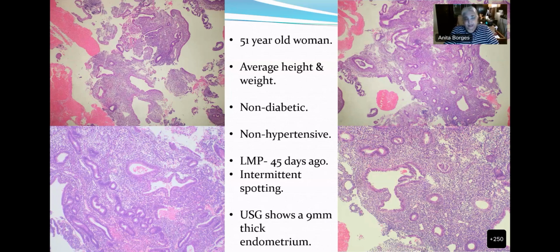And as Dr. Bhupesh said, this is one of the indications for doing an endometrial curettage. So what will you say? Come on, Bhavna, it's not difficult. Yes, ma'am. See, if you're able to describe what you're seeing, you don't have to go into great details. I see these kind of glands and that kind of glands.